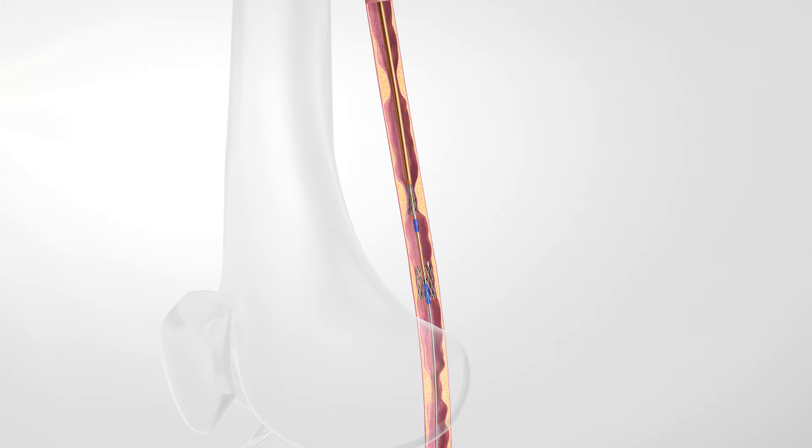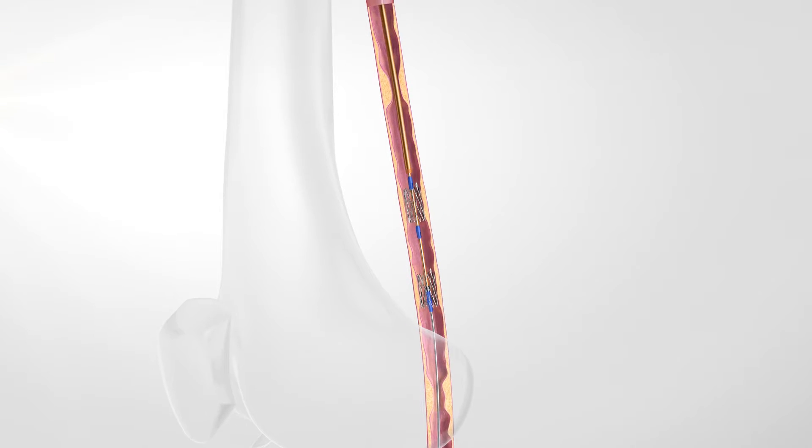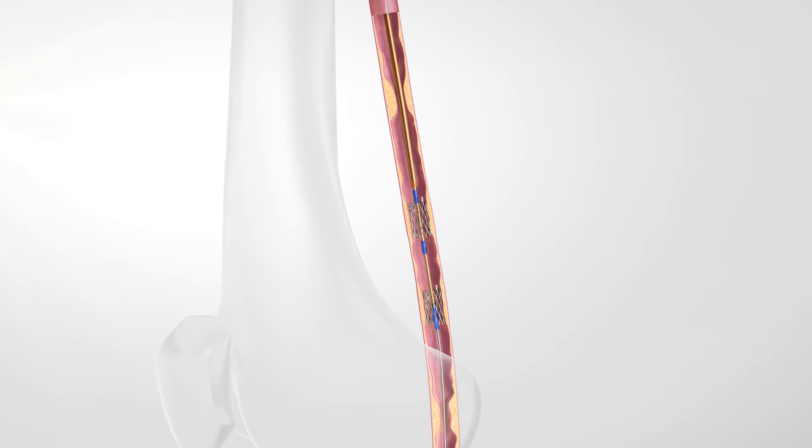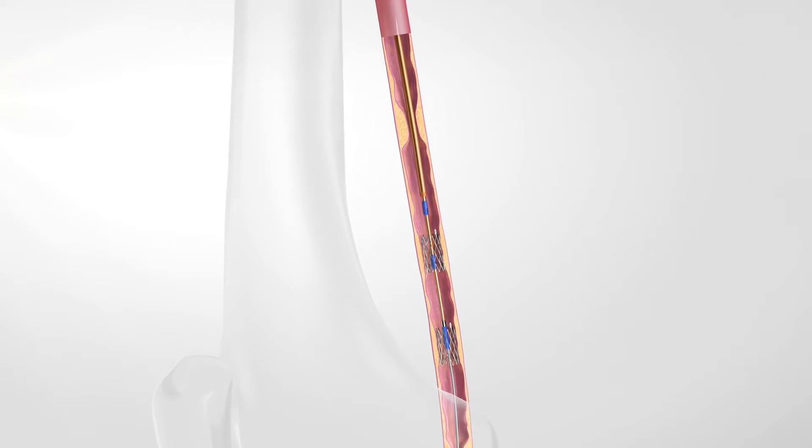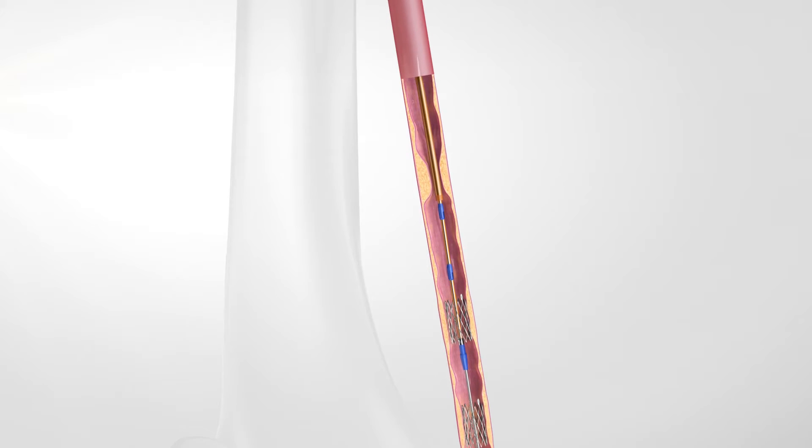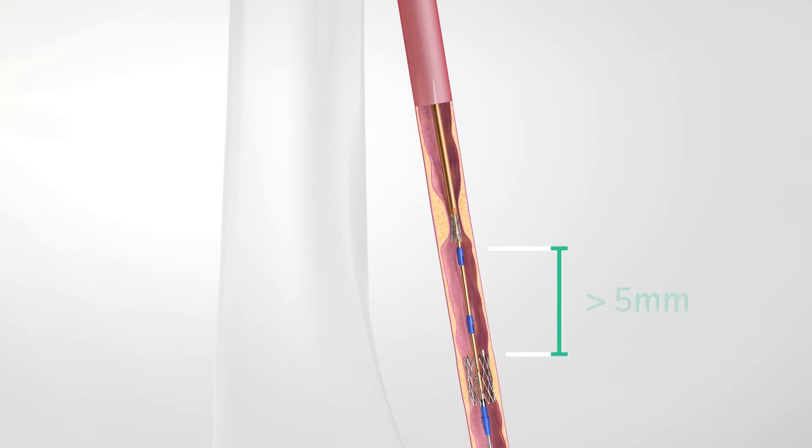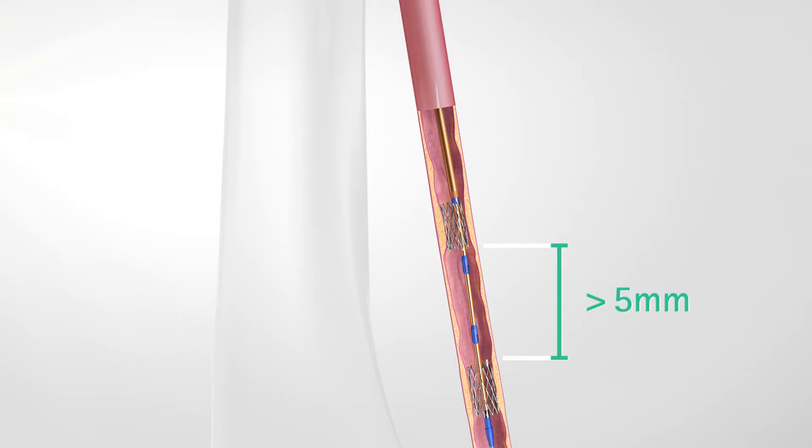Each stent can be implanted only where its scaffolding properties are needed. A distance of at least 5mm between neighboring stents is recommended.